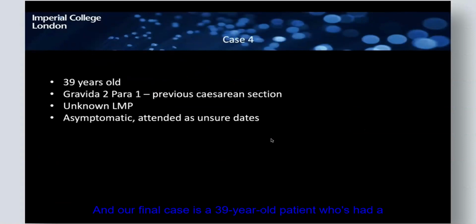And our final case is a 39-year-old patient who's had a previous cesarean section, attends not knowing her last menstrual period, but is asymptomatic, and has essentially come in for a reassurance scan as she's not sure of her dates.